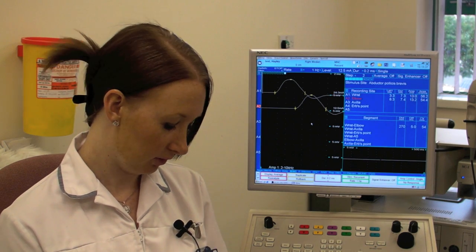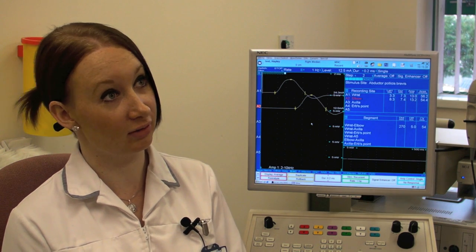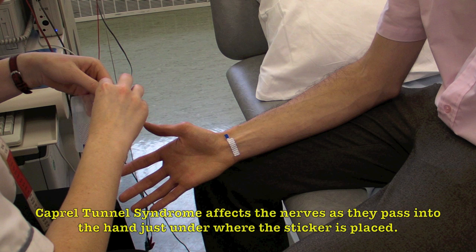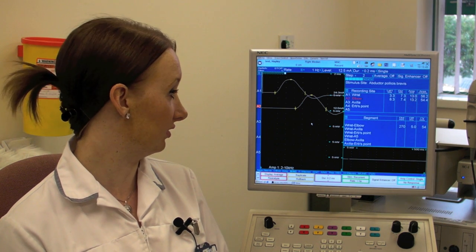The test we just did there was a nerve conduction study, which is testing how all the nerves are working. We're looking at the speed that the nerves are travelling at, mainly looking for any sort of entrapments around the wrist or the elbow. We can mainly test for carpal tunnel syndrome, which is an entrapment around this area that compresses the median nerve, and we can also look for peripheral neuropathies and other kinds of neuropathies as well.